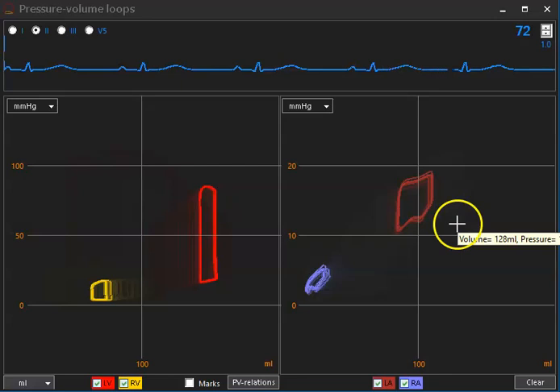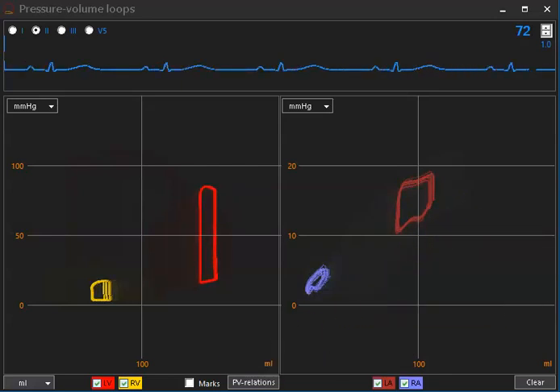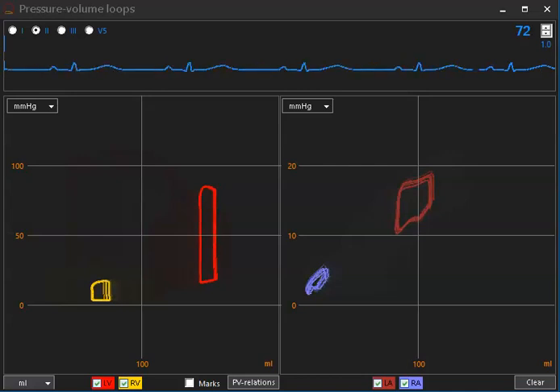And I will now demonstrate what happens when we modify right ventricular function. So we are starting with a very bad right ventricular function.